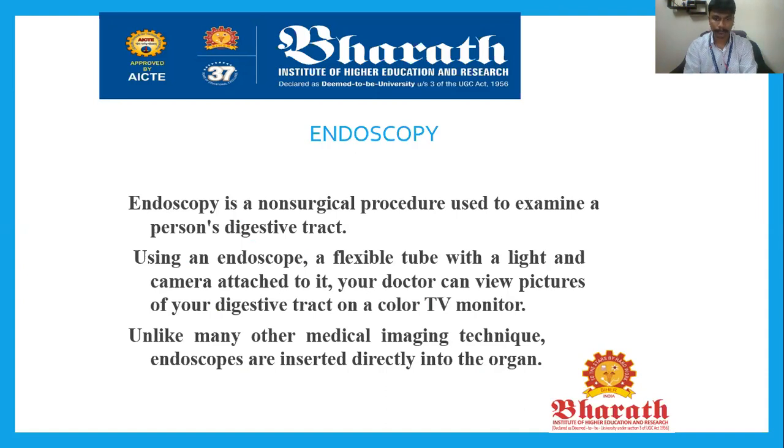Using an endoscope, a flexible tube with a light, a tube made up of a flexible material, a small LED light is mounted on its top along with a camera. A flexible tube mounted with a light will have a camera head on its top, and through it a doctor can view the internal architecture of your digestive tract on a monitor outside, without performing any surgery.